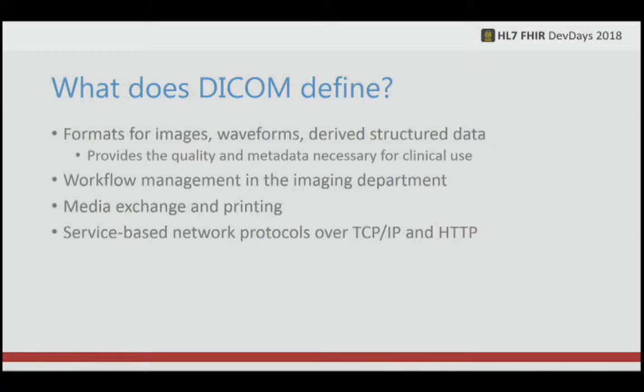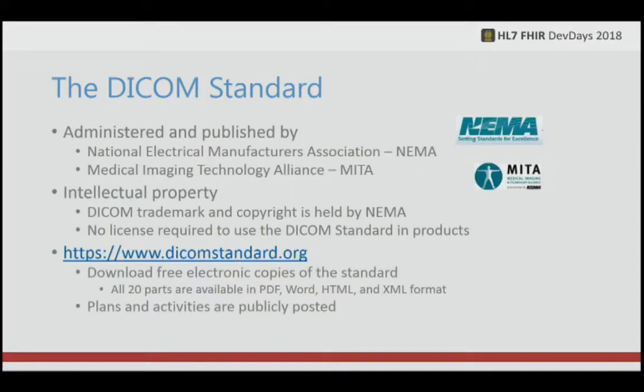So as I said, DICOM defines the formats for imaging, waveforms, and derived structured data. It does workflow management, so coordinating the communication with the modality and the imaging systems, media exchange and printing, and then also service-based network protocols over TCP/IP and also the web, which we'll talk a little bit about.